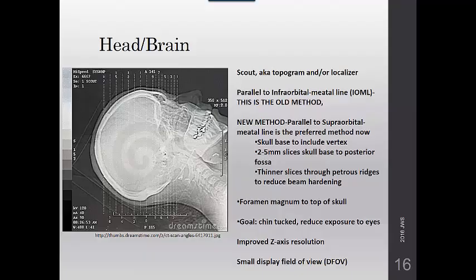The scanners are equipped with laser or light alignment lines. Utilize those lines to ensure that the patient's not rotated from side to side or that their head is not tilted to one side. It's more of an issue to be tilted to one side because that means that you're not getting a representative slice parallel through the brain. When it's tilted, you're going to be off a little.